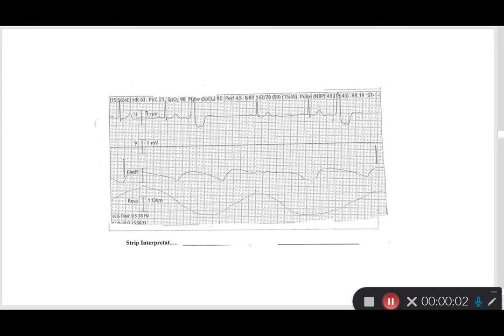Great, so this is the second part of the ECG review, and we're going to start looking at ventricular and heart block rhythms, which I think are the most difficult ones to understand. So remember with our ventricular rhythms, it's my heart again, we have a rhythm originating somewhere in the ventricles, and usually this happens from the Purkinje fibers that branch off those bundle branches.